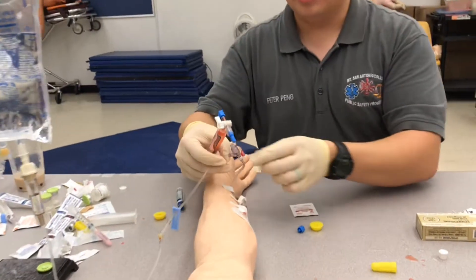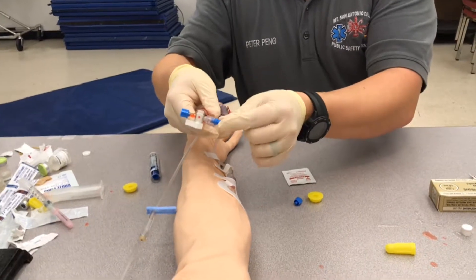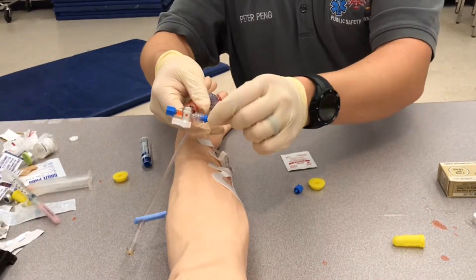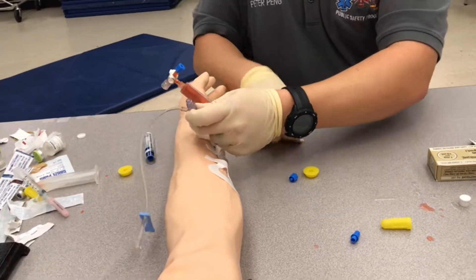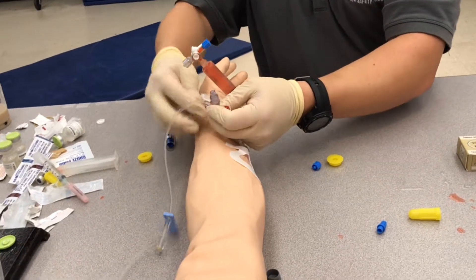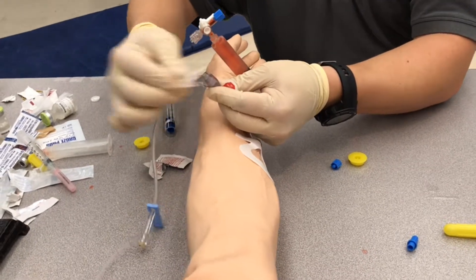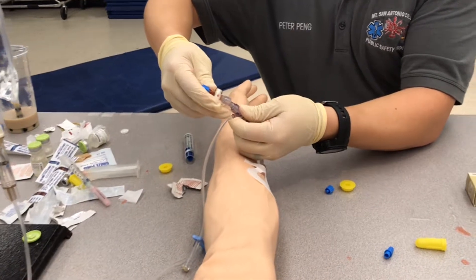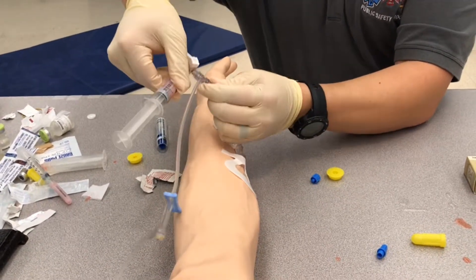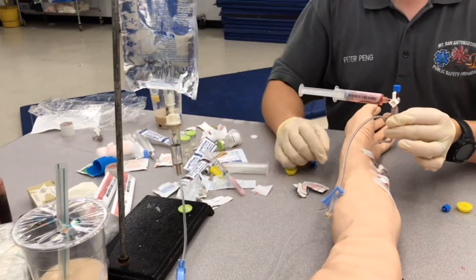We already have an IV established and we know the patient doesn't have any allergies. We're going to unscrew the male end, and with this port we're going to take an alcohol prep, clean it off, and connect the three-way stopcock. Our IV bag is running — we want that to be wide open for now.